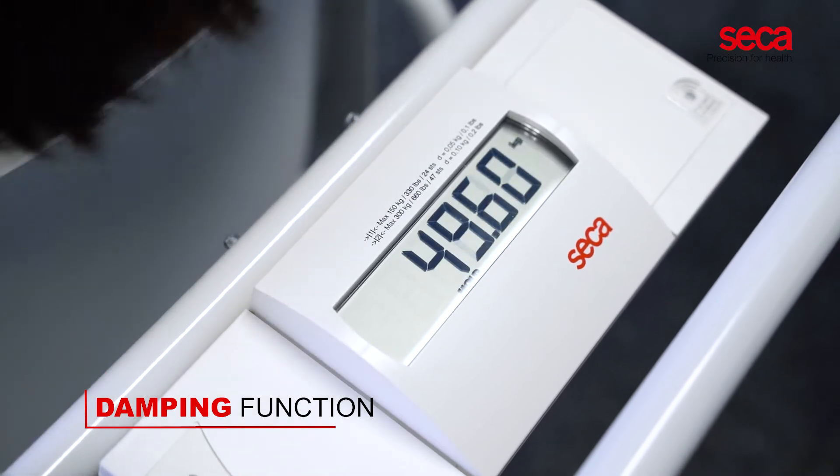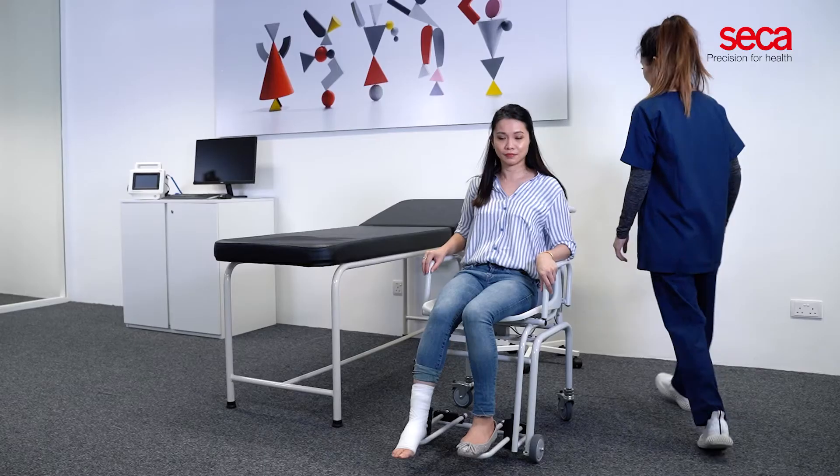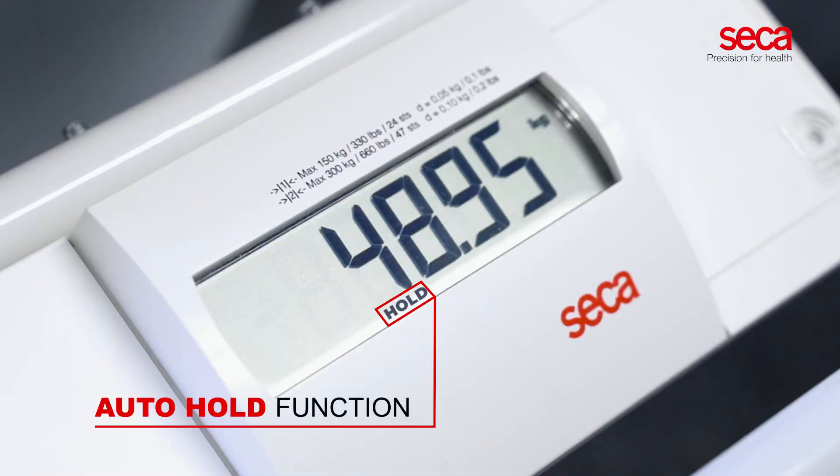Even with consistently strong movements from the patient, the accurate weight can be recorded just within seconds. With the auto-hold function, results are kept on the display whilst medical personnel attend to the patient's needs first.